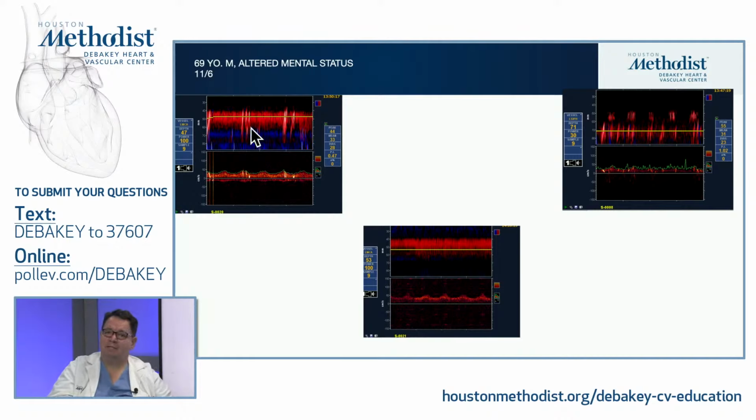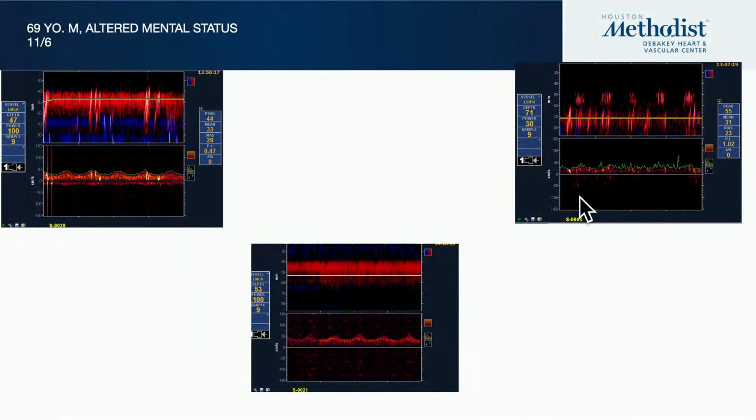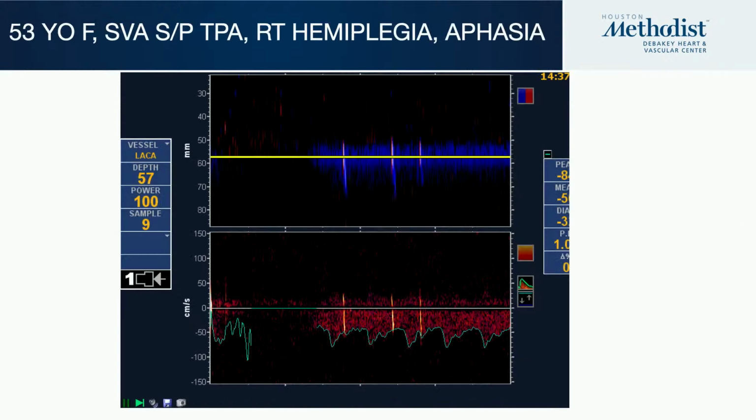So when you see this many, you know that there's a source, and this is like showering. This is 4 seconds. If it's 4 seconds you see this many, think about how many showers and how many emboli you see if you're just doing it for a minute or for an hour.